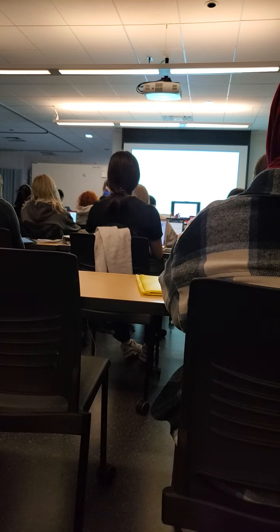So wall edema or hyperemia, and so these are like where our wall is thick and there's kind of hypoechoic layers in there. We want to put our color Doppler on, is this wall edema? Is it fluid accumulating in this gallbladder wall, or is it hyperemia, where we actually have increased blood flow to the wall? So we want to be able to distinguish one from the other. So we're going to use our color Doppler. And a lot of the pathologies we're going to talk about today are going to kind of relate to this wall edema thing. So making sure we have wall edema or hyperemia.